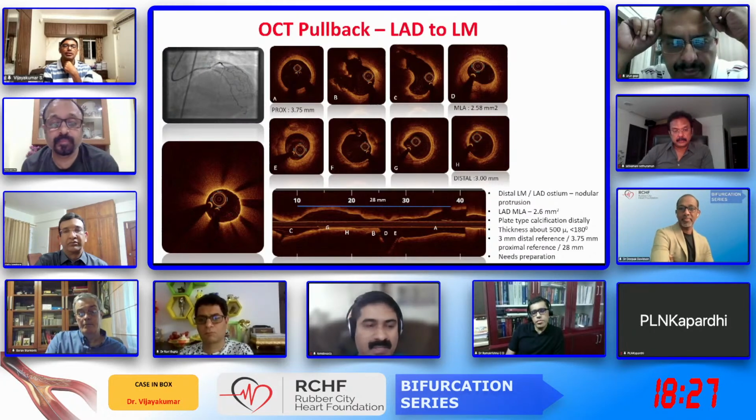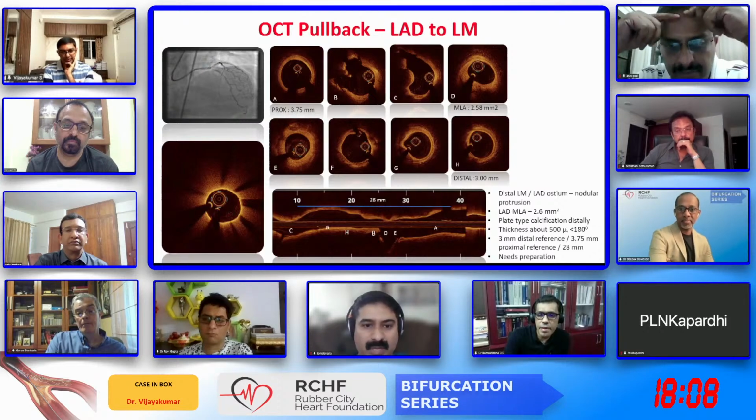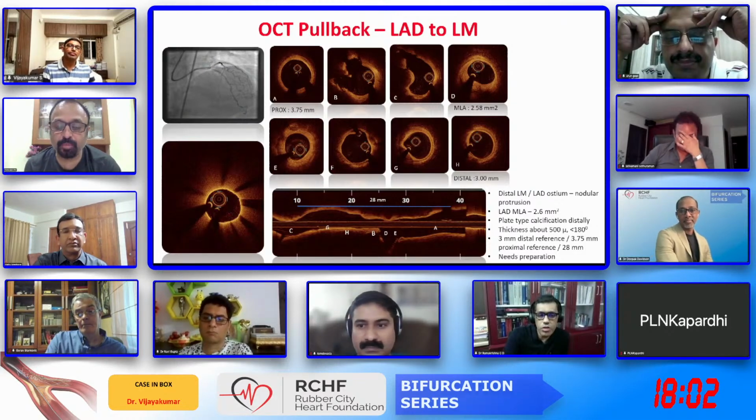So my working strategy, in case the patient cannot financially afford it or I have not explained the IVL in advance, is to go to the circ ostium, sit at the ostium and ablate for a few extra seconds, so that passage of the scoring balloon is much easier and my post-stenting optimization is easier. Thank you. Talking about static rotablation. He's talking about Vijay, rotablation.